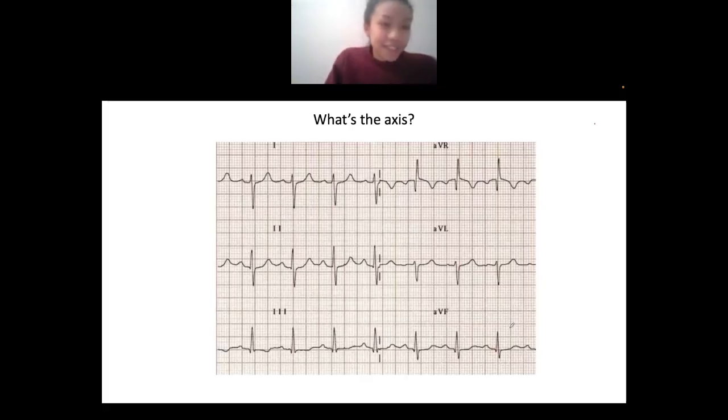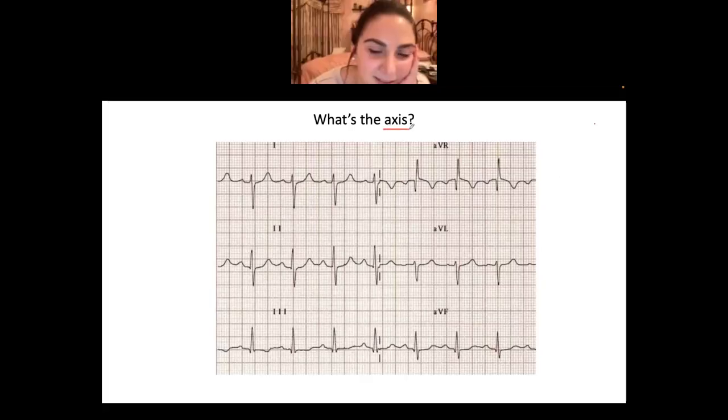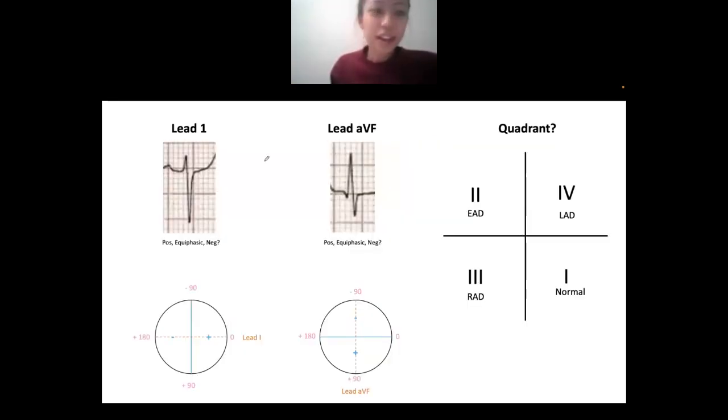Riley, tell me what your answer means. Say it in words. What's 3? Come on. Like a right axis deviation. Good. Okay. So you guys both got it.